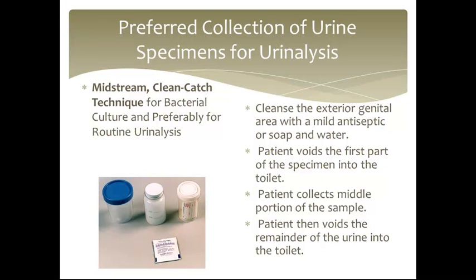The midstream clean catch technique for bacterial culture and preferably for routine urinalysis. So you want to cleanse the exterior genitalia area with mild antiseptics or soap and water. A lot of times we will explain, and even in some textbooks you will explain to a patient to spread the labia. Using the term labia, they might not understand what that means. So you might want to use simpler terms for some patients that might not understand by saying spread the lips of the genital area, and they might understand that.